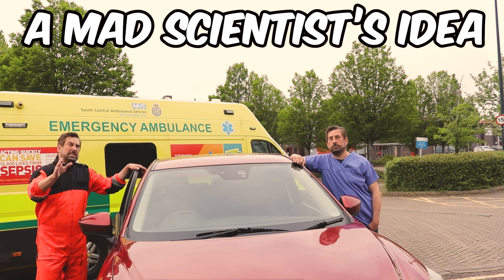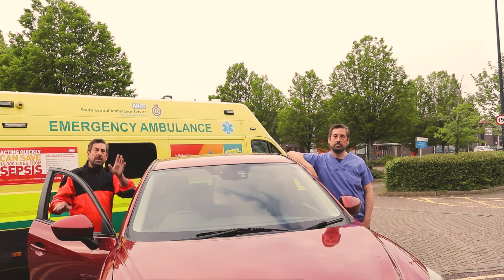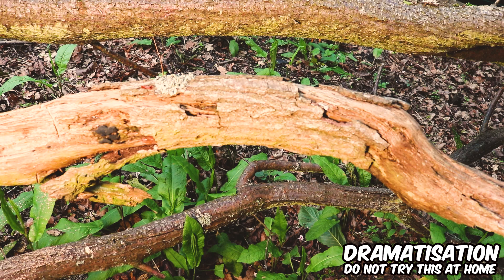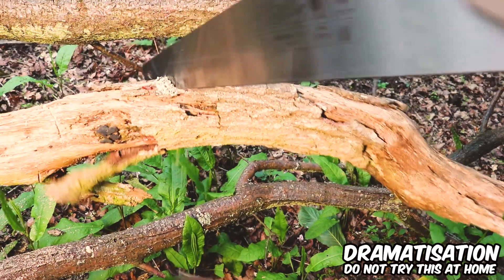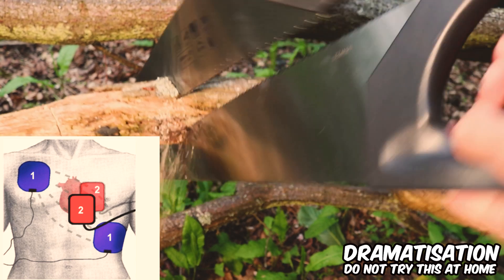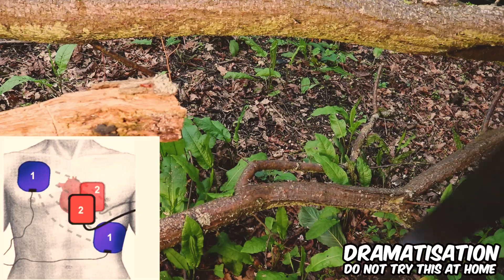It sounds like a mad scientist idea straight from Frankenstein, but it actually makes sense. To show you why, imagine you need to cut off a branch. You could do it with one saw, but it will take time and many moves. Things go faster if you use two saws from different directions. This is a simplified version of what happens during double defibrillation — the branch represents VF, one full saw move is your biphasic shock, and using two saws from different directions mirrors the mechanism of vector change: placing the second set of pads in a different position.